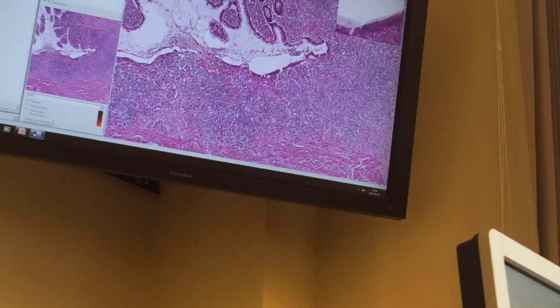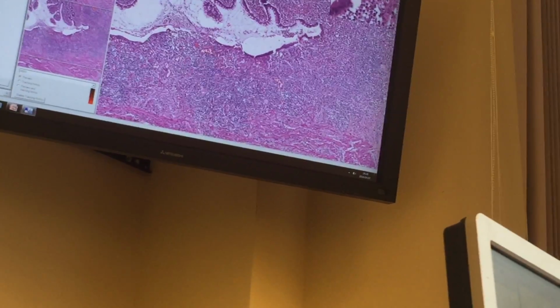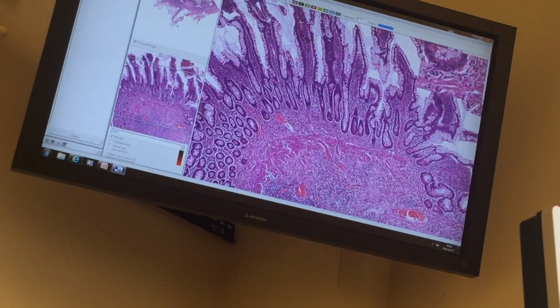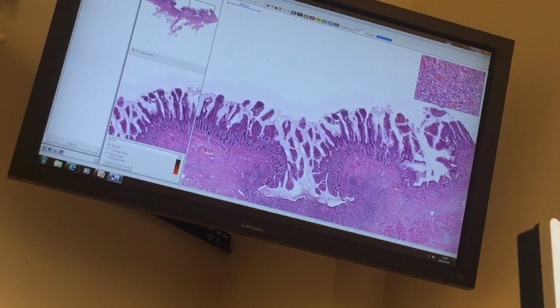Okay, so healing. And the villi here, we can say they're intact? Where it's ulcerated, they're not. No, of course, but the next one, the next to it. Yeah, but it will happen the same way, I think. This is what it means, segmental.